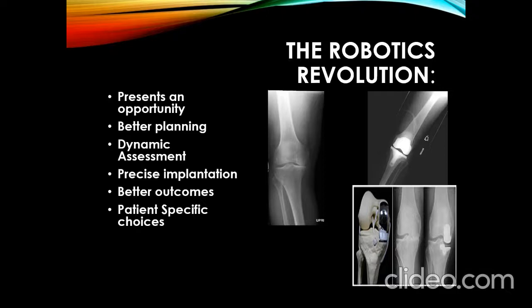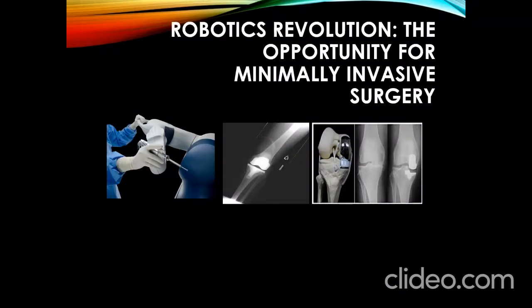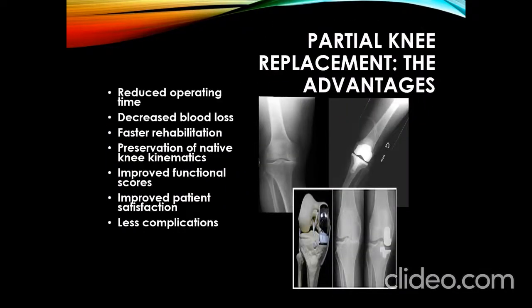Where it may be the future for knee replacement surgery is that it gives surgeons the confidence to suggest more minimally invasive surgery, such as partial knee replacements. What we know is that partial knee replacement is advantageous compared to total knee replacement. We know this from our experience with doing this the conventional way. It is associated with reduced blood loss, patients recover a lot quicker, and patients are much more satisfied with partial knee replacements.